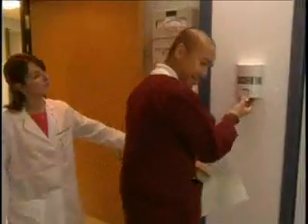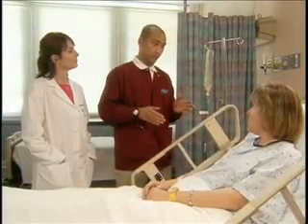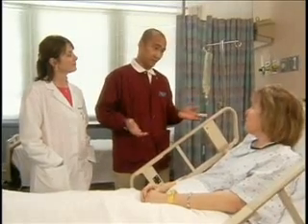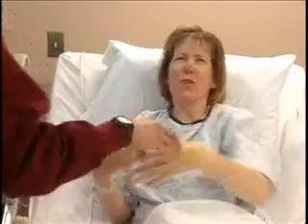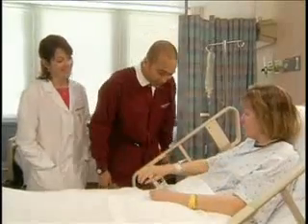Hi, Mrs. Hanson, we're back. You're doing such a good job drinking on your own. Your doctor has decided to stop your infusion. Remember, though, that we're giving you that medication through your IV for your infection, so I'm not going to take the whole IV out. I'll leave a short piece so it can give you your medication, all right? May I check your ID band? And please tell me your name. Catherine Hansen. Let me take a look at your IV site.